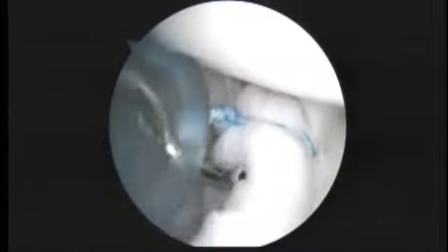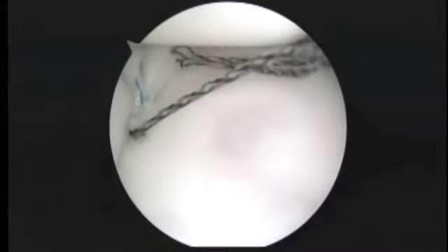So now we're going to go ahead and place a mattress stitch here without an anchor. We'll go ahead and show you how we do that. Back out right. Turn right. Here's our hook. We're going to start here. Then we're going to roll back. Get some of the joint capsule here. Bring that through right there. So we'll go ahead and load that, or feed that through and retrieve it carefully. And then we'll load that with a suture, and we'll show you some more in a minute.